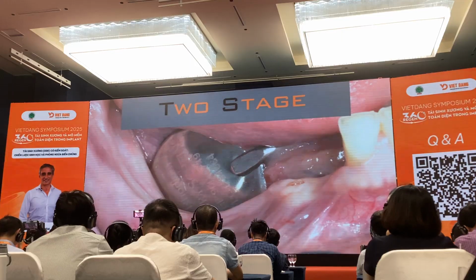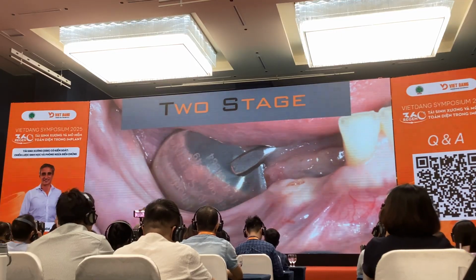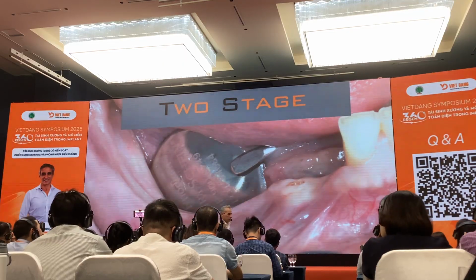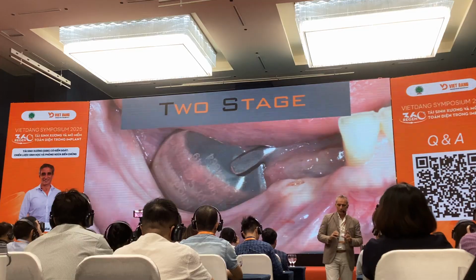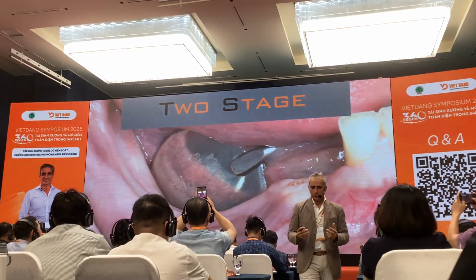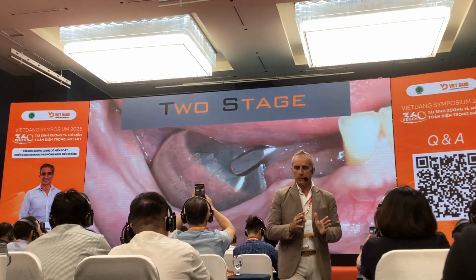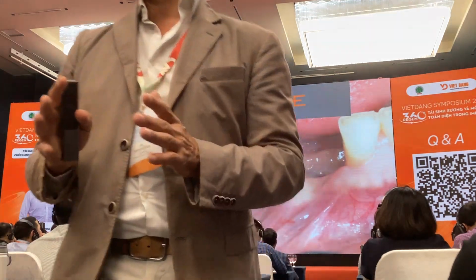Instead, this is the classic 2 stages approach. The 2 stages approach is a surgical procedure that separates the GBR from the placing of the implants.